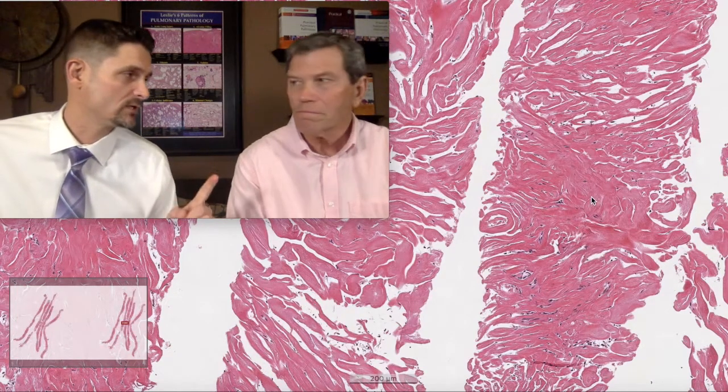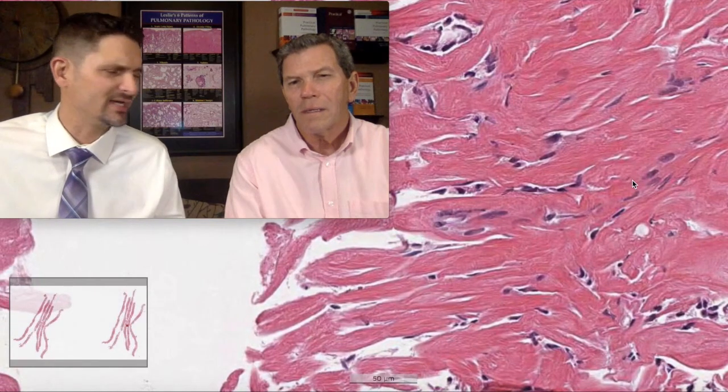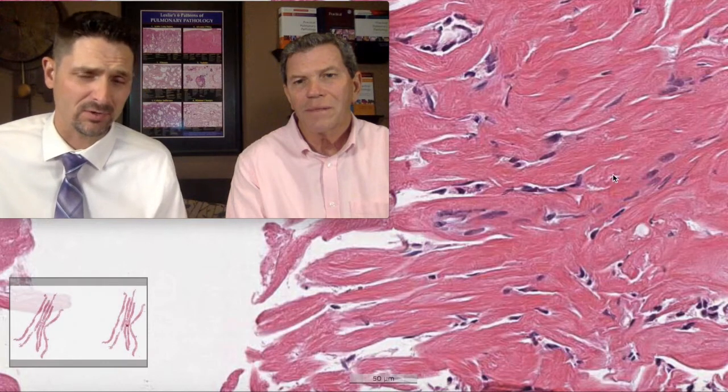I'll tell you the one other thing that bugged me about this when I was sharing it with the visitors: there are areas where the cellularity is a little increased, and they're a little bit atypical and hyperchromatic.